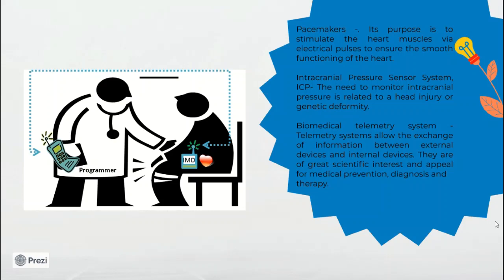Biomedical telemetry system. They allow the exchange of information between external devices and internal devices. They are of great scientific interest and applied for medical prevention, diagnostic and therapy.